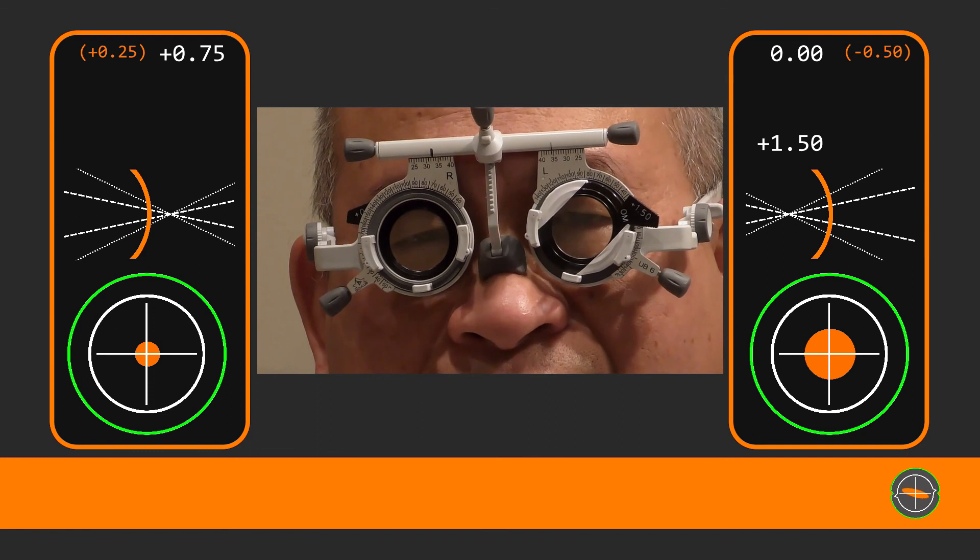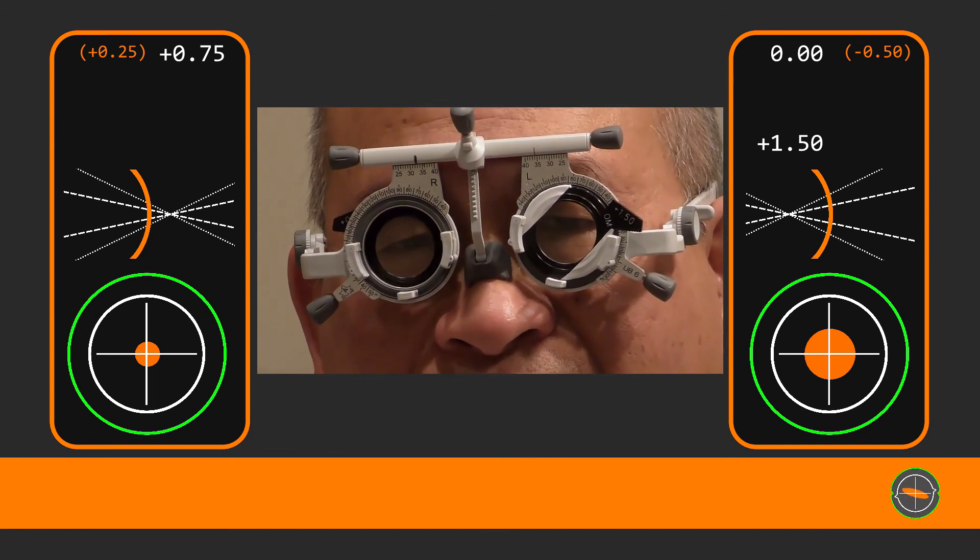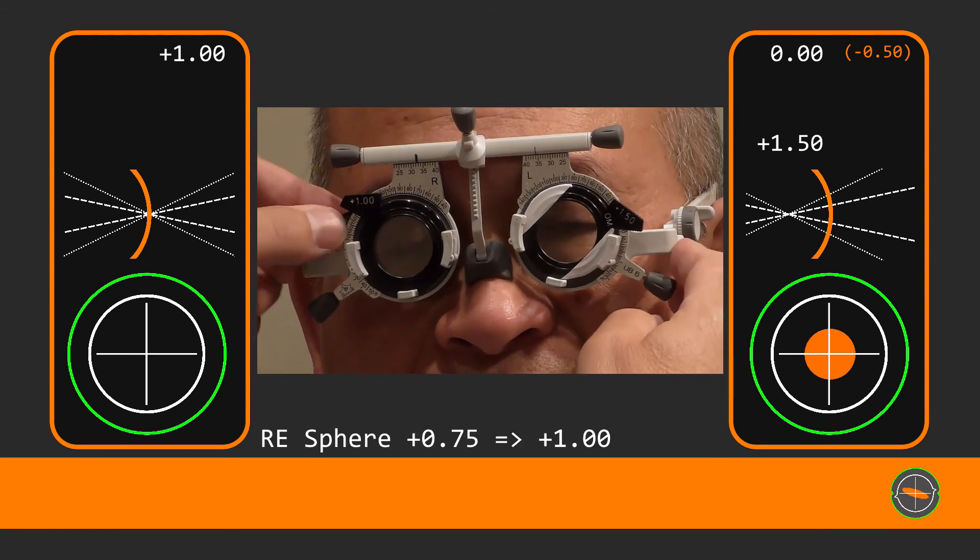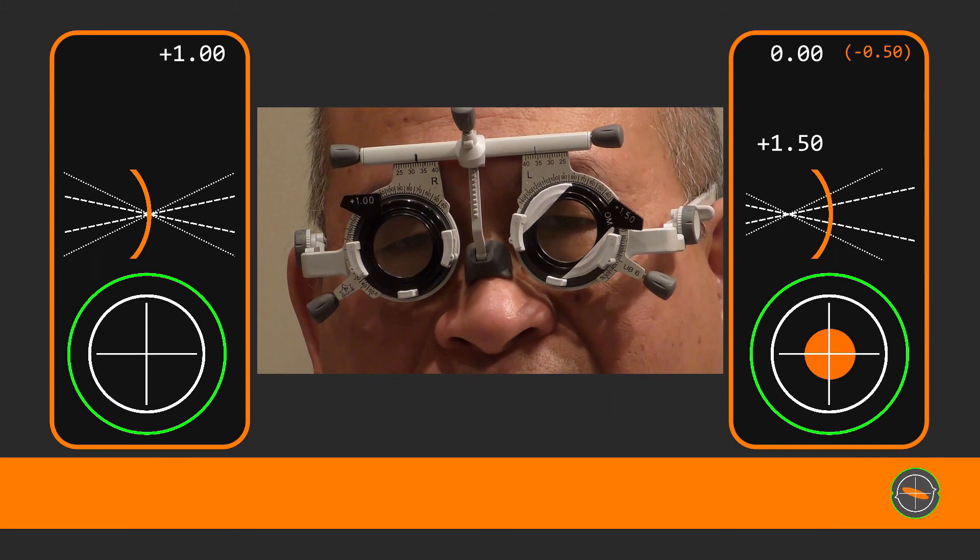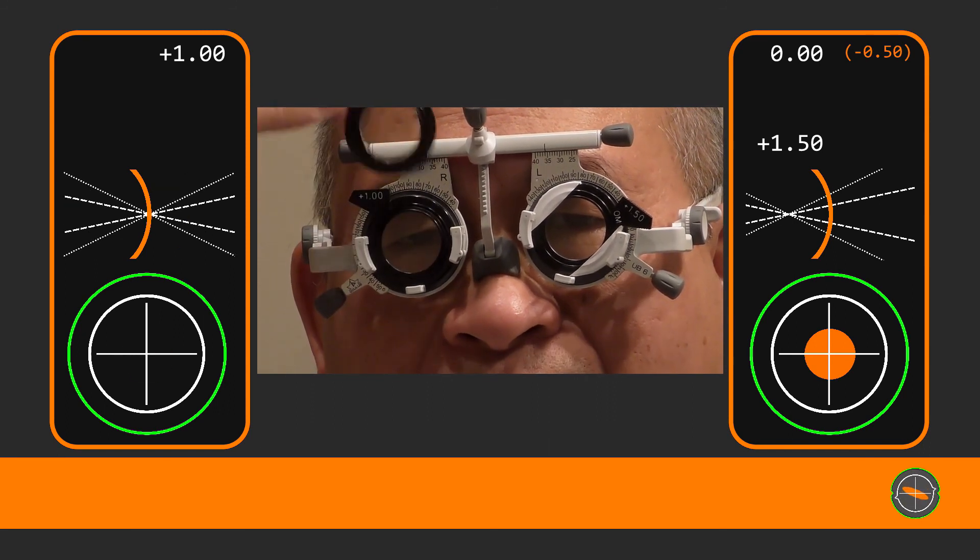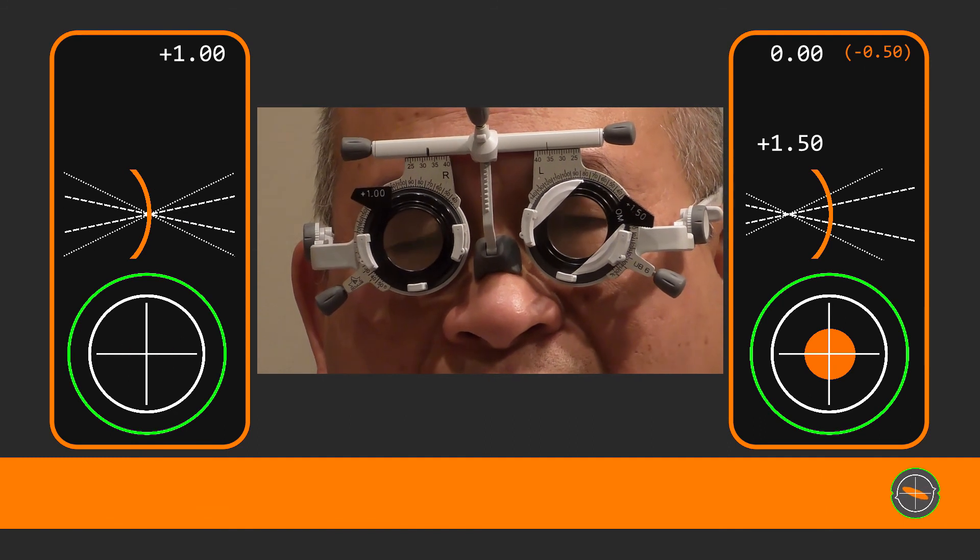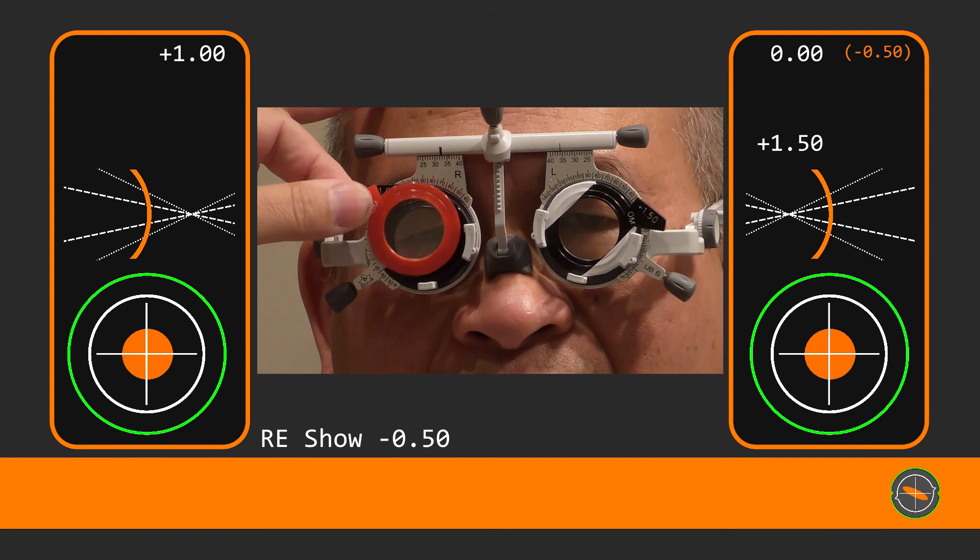Let's continue. And better with the lens. And better with this one or without, better without it. And better with this one or without.